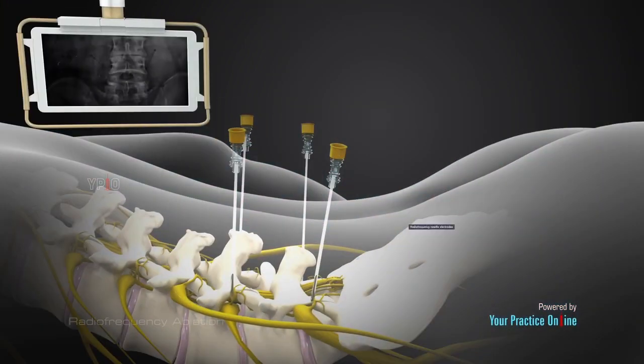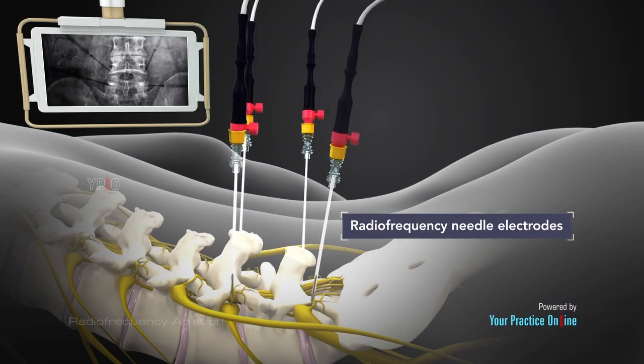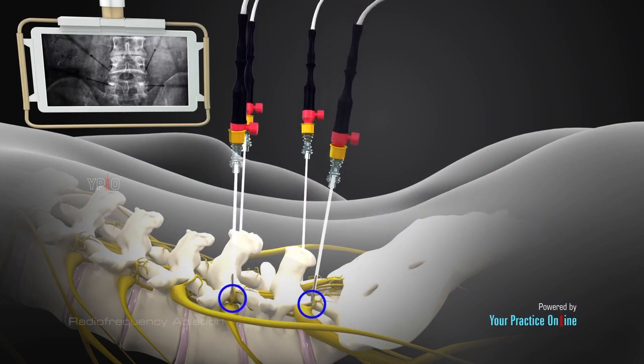During the procedure, your doctor will direct special radiofrequency needle electrodes close to the affected facet joints in such a manner that the needle tip lies near the medial branch nerves. This is performed under the guidance of a fluoroscope, a special kind of X-ray machine that displays live images on a monitor.